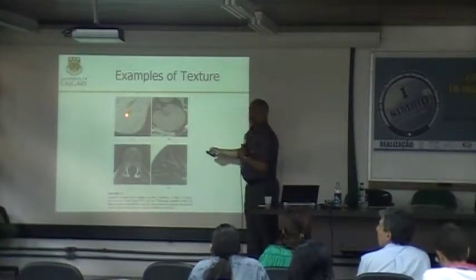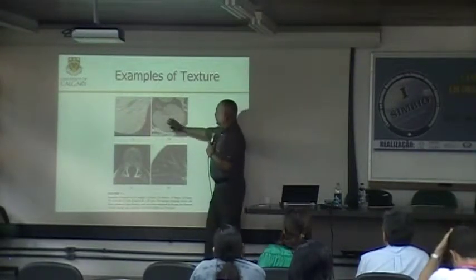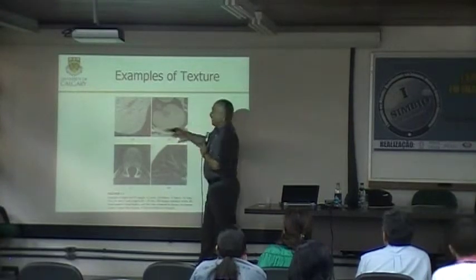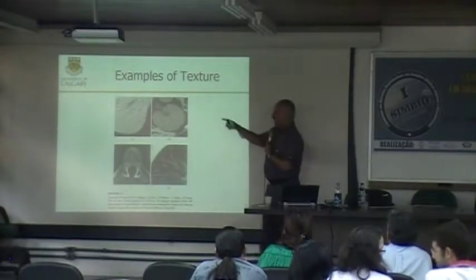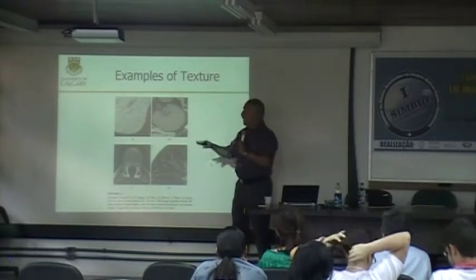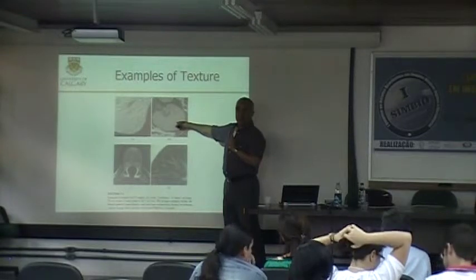As compared to this, this is quite rough. If you were to convert this to tactile sensation, this is rough, like granite. This is smoother, this is very smooth. But we are talking about visual texture in terms of variation of gray level, intensity, here, X-ray attenuation converted to Hounsfield units.